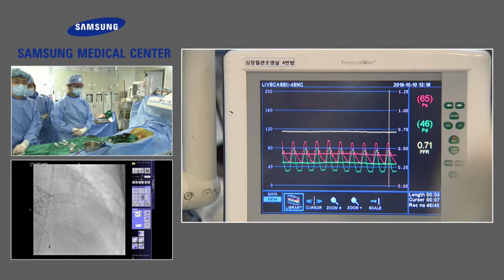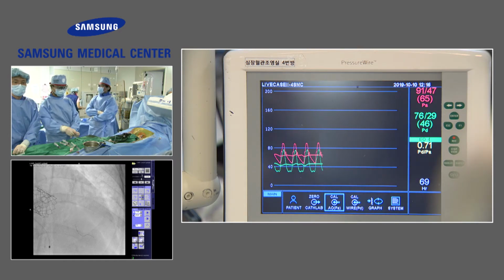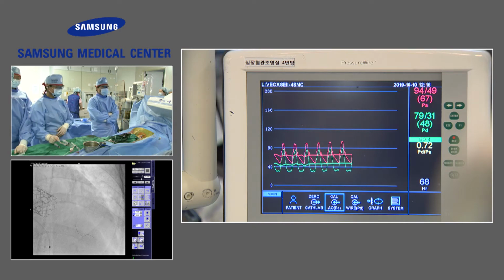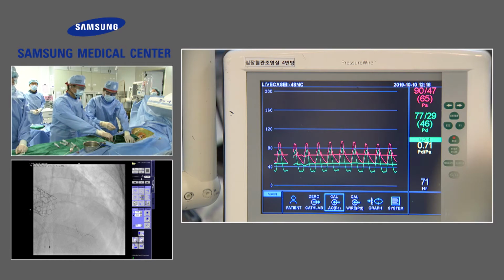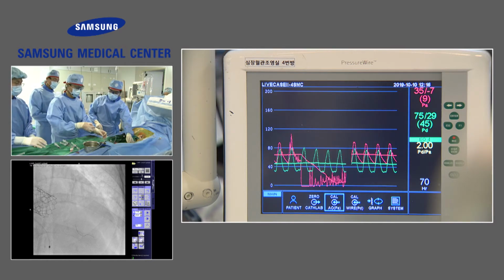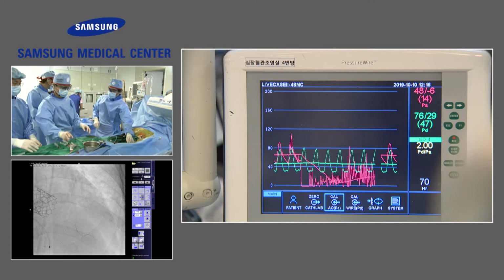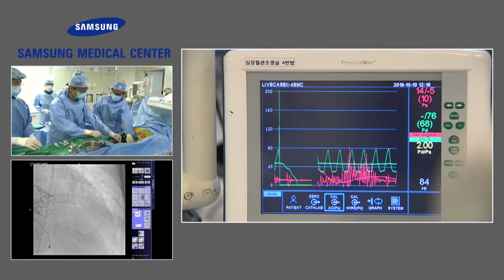This is the coronary session. Show us your technique of the stent. Okay, easily. This is so fast. Impressive. So, do you want to stent the LAD? Why not? The FFR value is less than 0.8. Okay. Stent it.